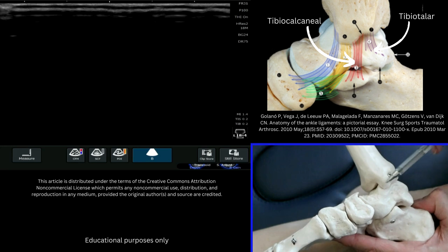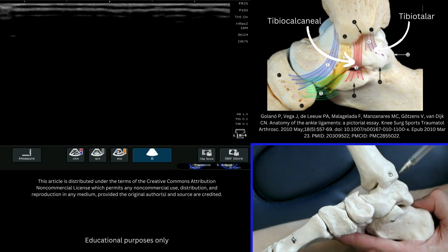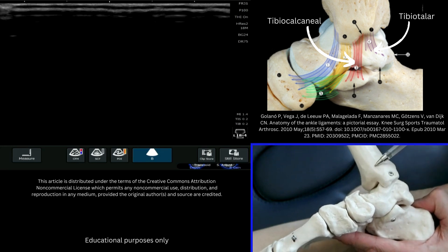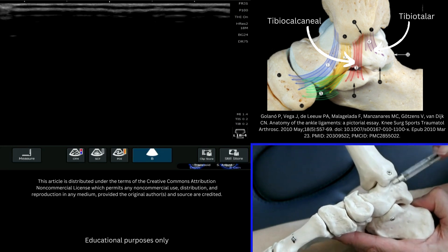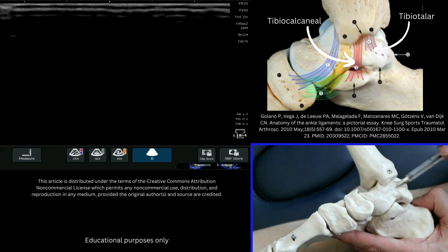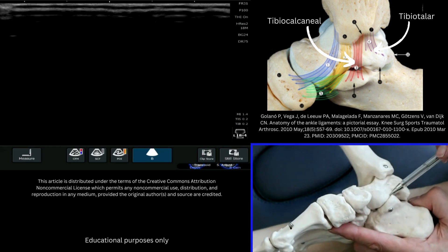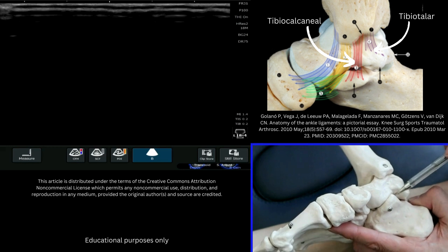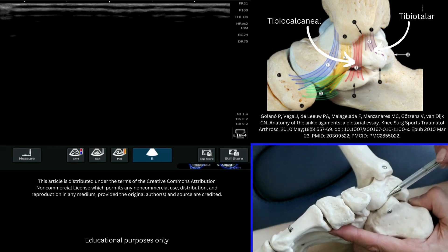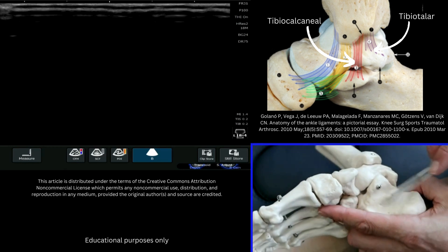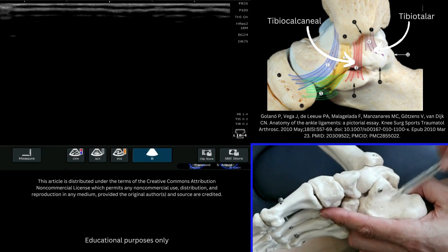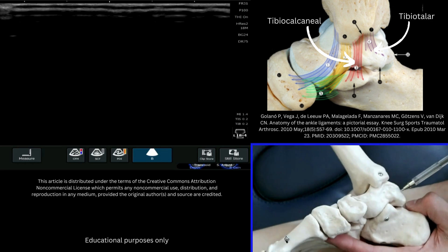We have the medial malleolus here, which is an important skeletal landmark. We have the talus sitting a little bit inferior to it, and then we have the sustentaculum tali, this bony protuberance which is attached to the calcaneus bone or the heel bone underneath.